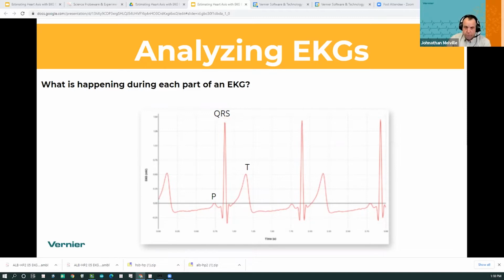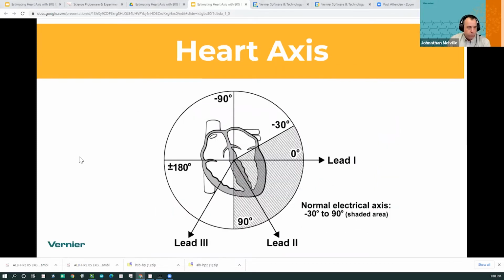And normally, if you were doing an EKG trace, that's what you would do. In our EKG lab analyzing heart EKG, you record an EKG, and the students actually calculate heart rate, and then they look at the different components of the EKG, and then link those to different events that are happening in the heart, both the time difference between the P and QRS, and also just where they are and what they're responsible for.